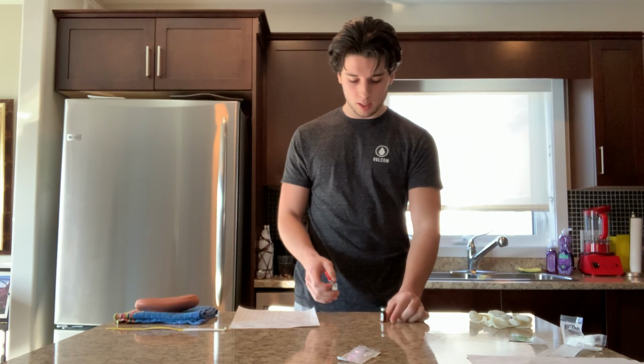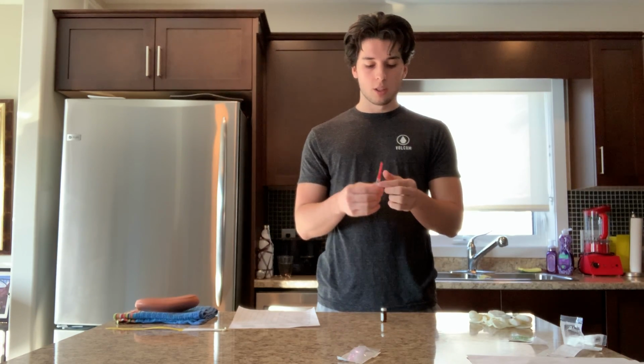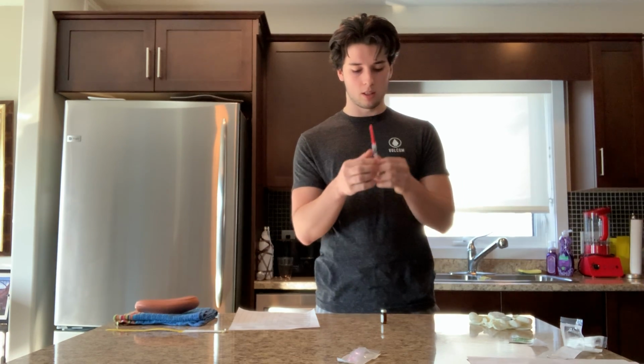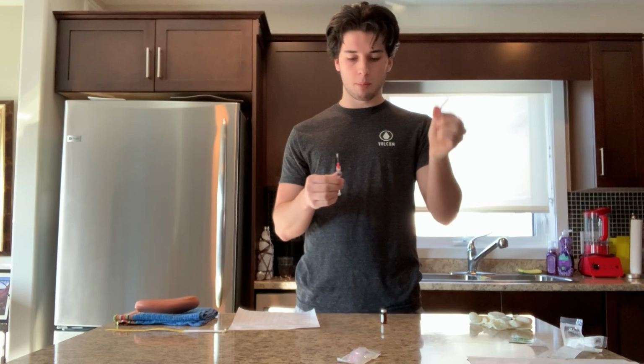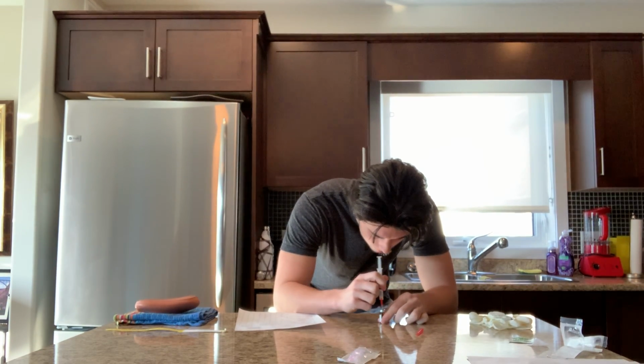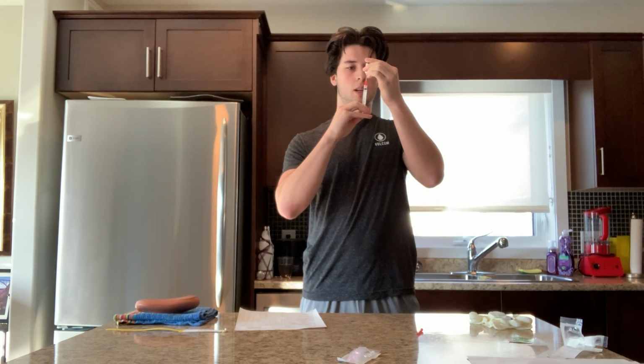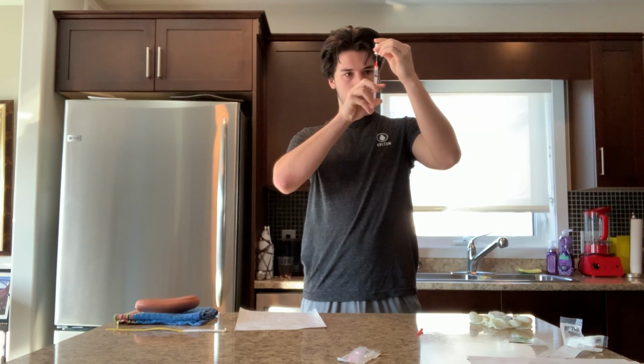So we saw that we needed the 1 milliliter to get the 5 milligrams we desire. So we'll be pulling up 1 milliliter of air to inject into the vial. So now I can uncap my syringe and inject air into the vial. So I'll start off by injecting my air and then pulling up 1 milliliter of fluid.